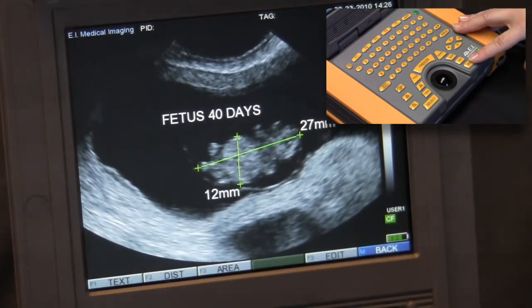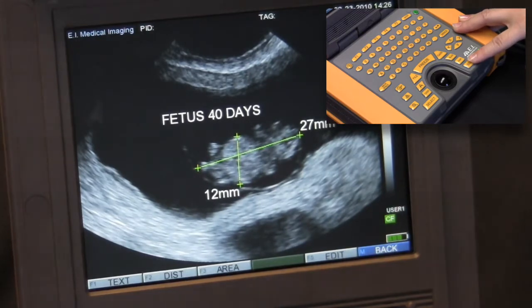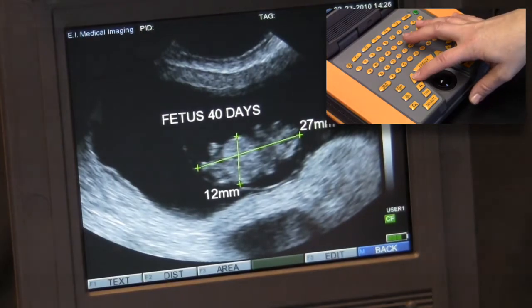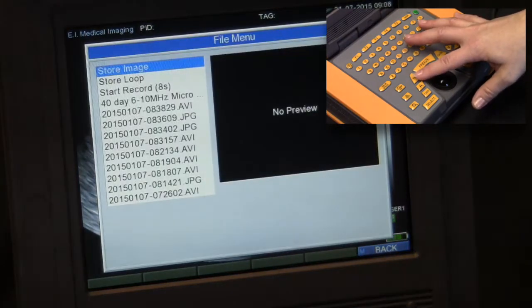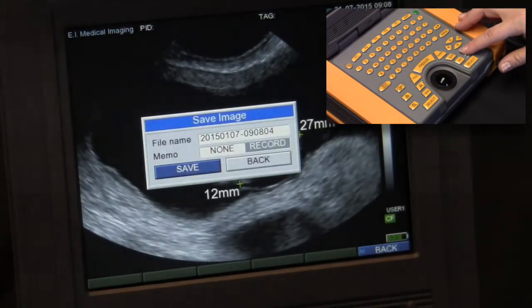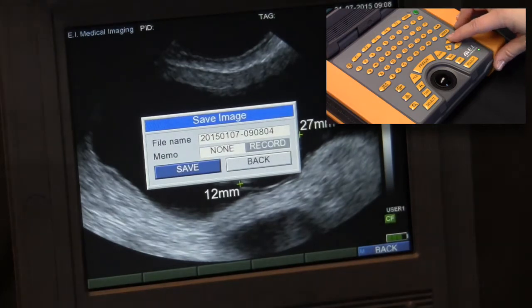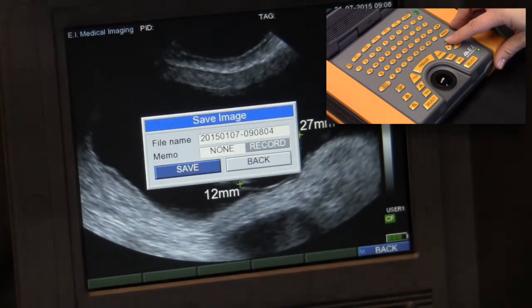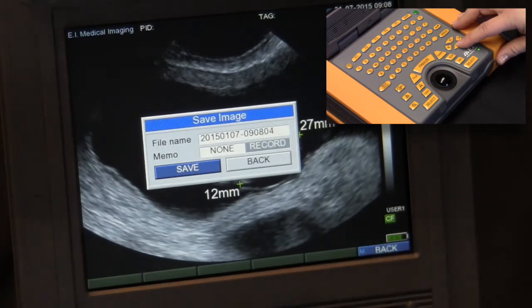This image can be saved as a separate file from the original clip by pressing file, then selecting store image, naming or voice tagging the image if you prefer that over the default time-date stamp, highlighting save, and pressing select.